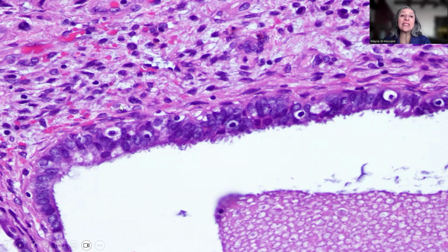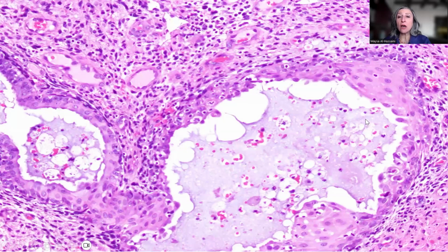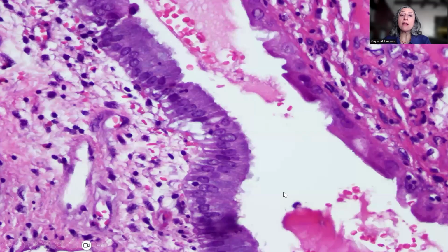Mind you, here the stroma is exactly the same stroma that I shared with you in the slides before. And here is another focus where we have the glandular epithelium, now this time showing the squamous metaplasia, but still the stroma showing the exact same appearance. And another focus where we have perhaps here some ciliated epithelial metaplasia, and here we have mucinous metaplasia. And again, both are seen within the confines of the glandular epithelium, the benign proliferation.